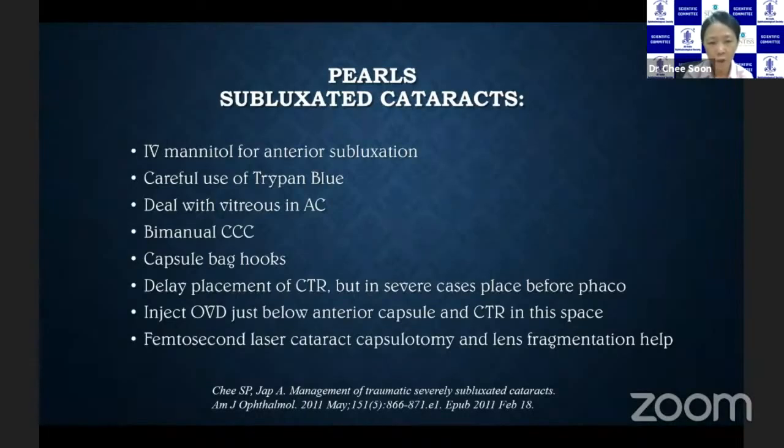I was asked not to show you femtosecond laser, although I do this quite commonly in these cases where the pupil dilates well, and really with the lens fragmentation, you have dense cataract. These really help to make the case so much easier.